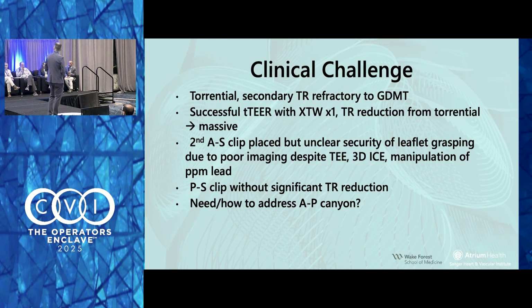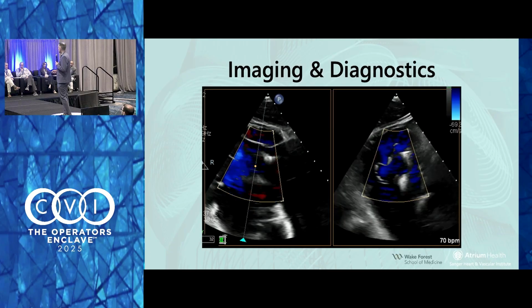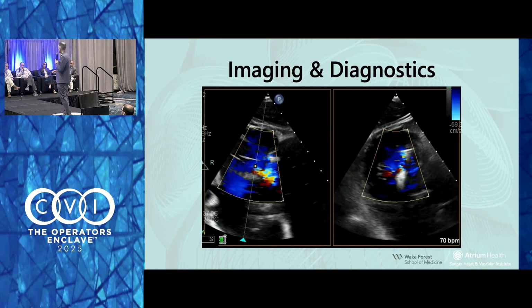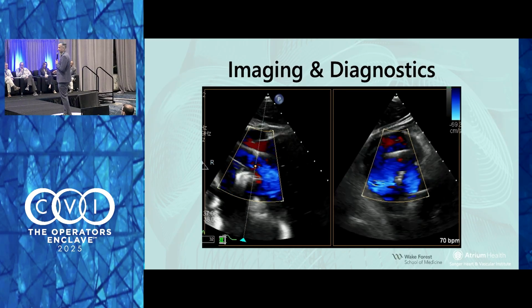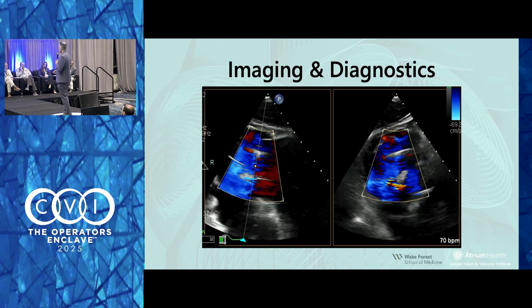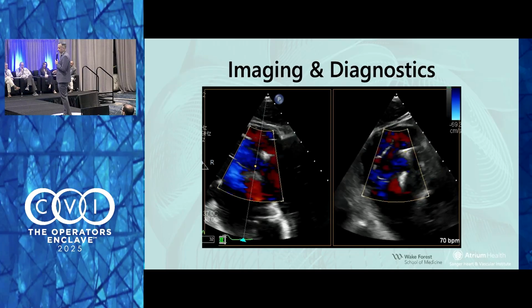Difficult one. Yeah, we tried that. We couldn't confidently grasp the septal leaflet with the grippers.